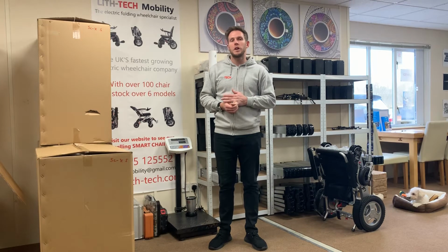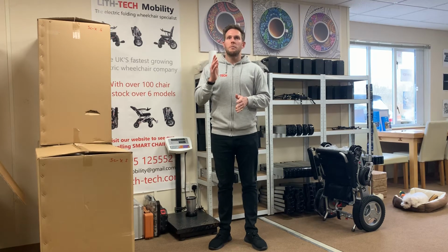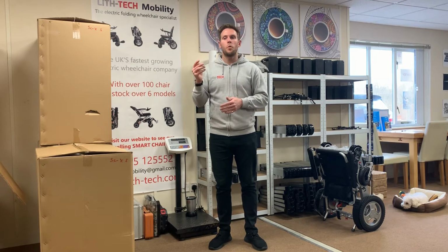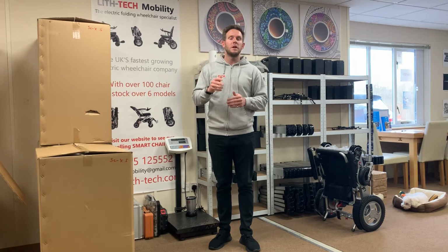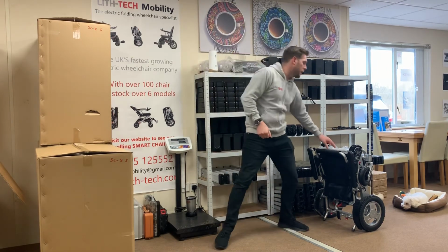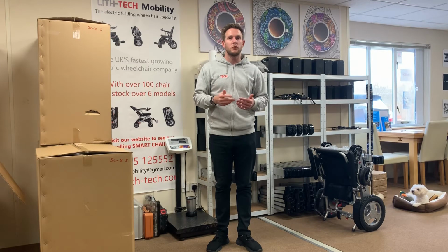I would also say that it's basically also the quality of the motor. The better the quality of the motor means it can be better in electric mode, but more importantly, when you switch the little red toggles at the back of your motors over to push mode, it's going to be far easier to either push someone in freewheel mode or move the chair around the house, from the foot plate, for example, like towing it like a suitcase, or just pushing it from the legs. So rule of thumb is, the better the motor, the much easier it's also going to be to push in freewheel mode.